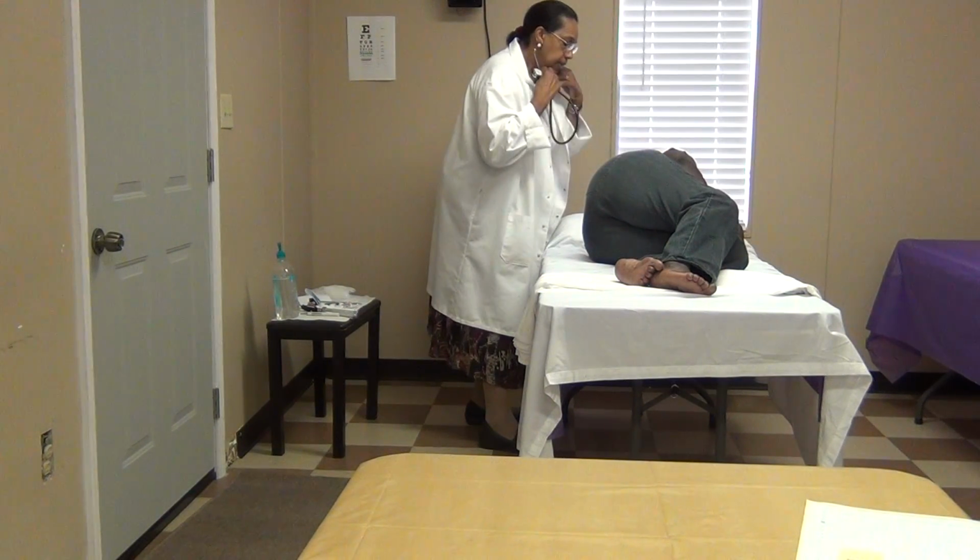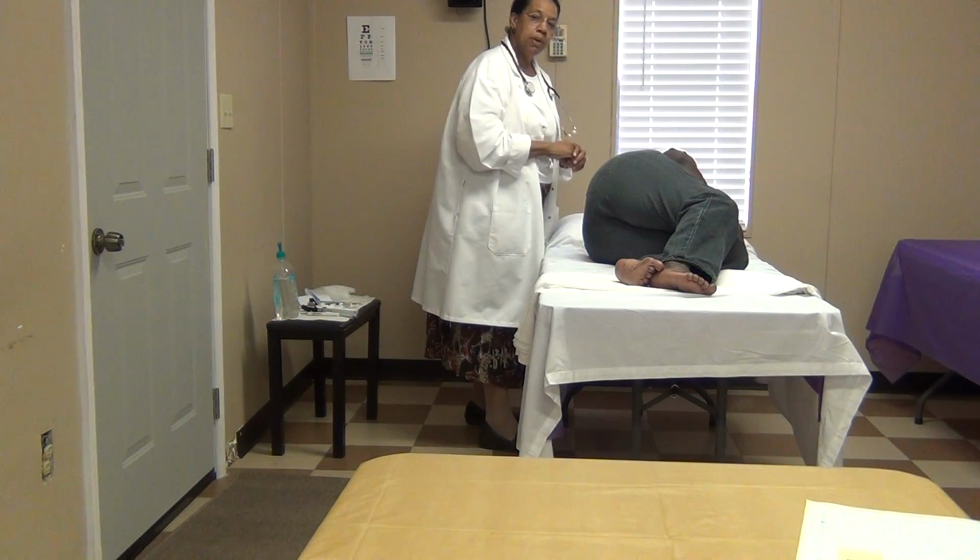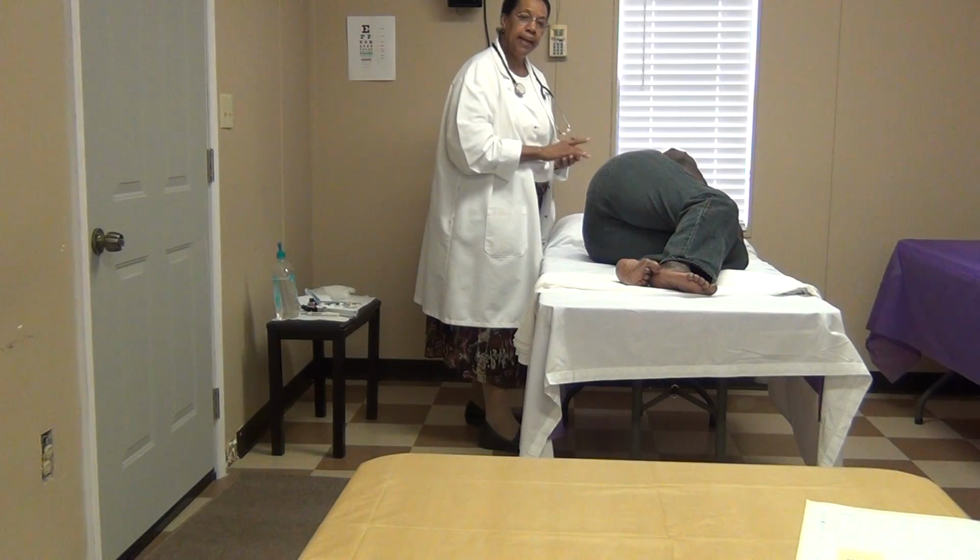Okay. There's no adventitious sound noted. I check my upper and my lower lobes posteriorly and laterally.